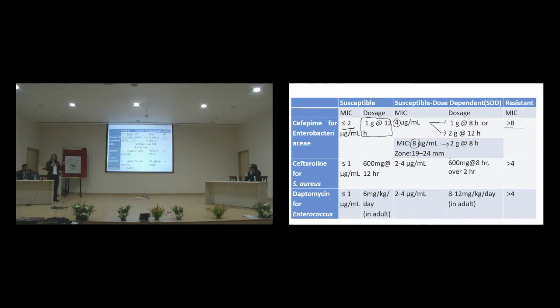Okay, so the MIC breakpoints along with the doses have been clearly mentioned, and with these recommended doses, there is more probability of a good clinical outcome. If it is more than 8, it is taken as resistant.